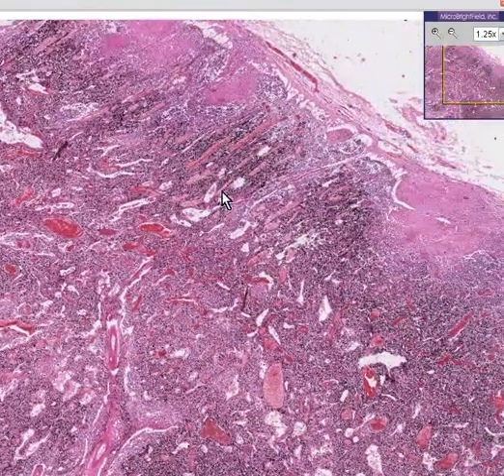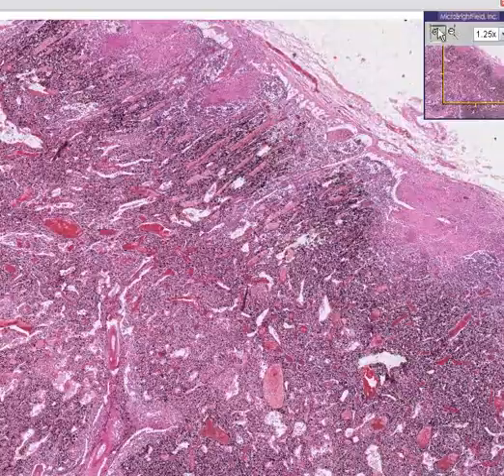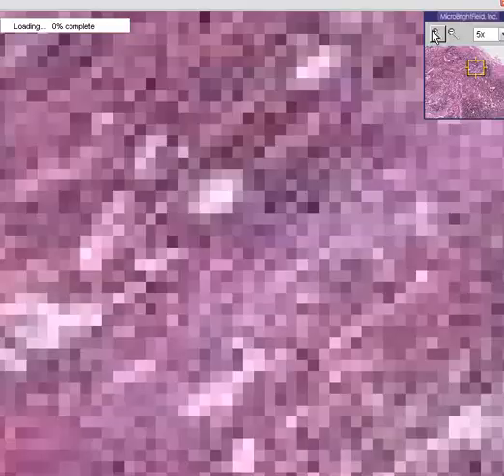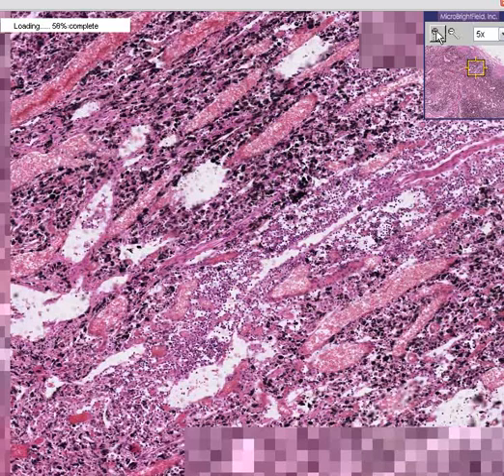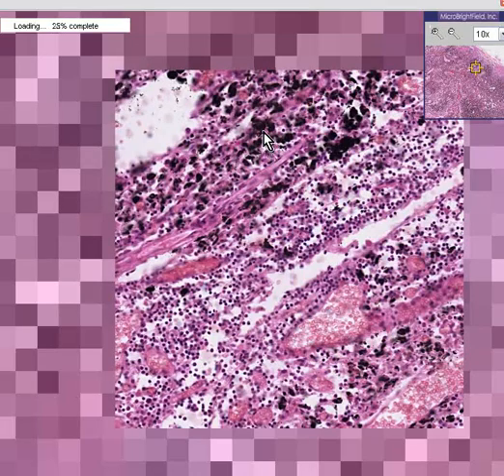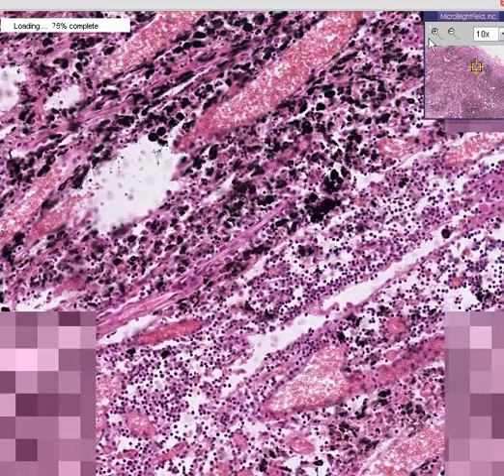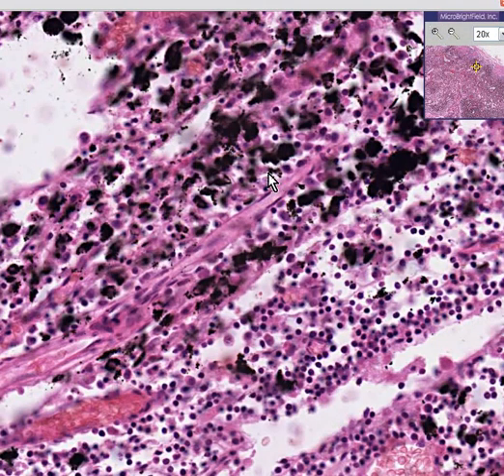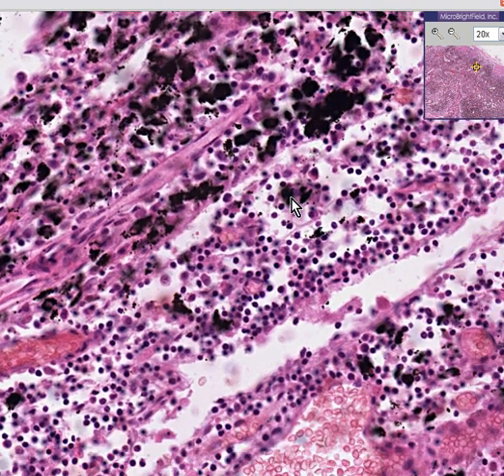One of them is the presence of this dark staining within the macrophages or histiocytes of the lymph node. And if you notice, this is not a golden brown pigment like you see with hemosiderin or bile. This is very, very intensely black. This is soot. This is anthracotic pigment. This is anthracosis of the lymph node.